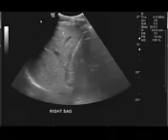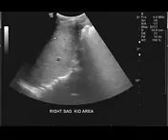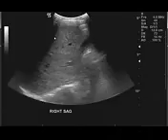Okay, so one of the things to remember is the liver is unfortunately at risk of becoming fatty infiltrated. And when we image and the liver is fatty, it is more echogenic than normal. You can see some of these artifacts again entering into the gallbladder from the outside in. So here we're getting to the porta hepatis. This is a sagittal display. The intrahepatic cava is on the undersurface here of the liver. This is the main portal vein.